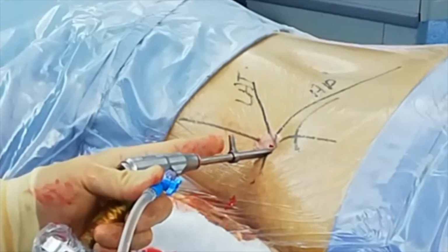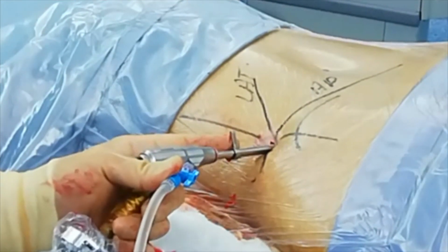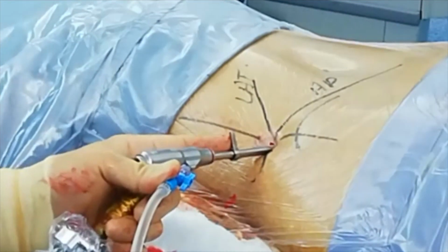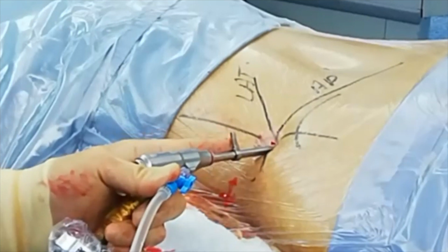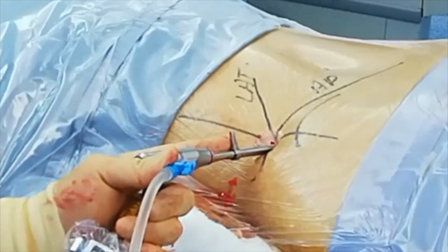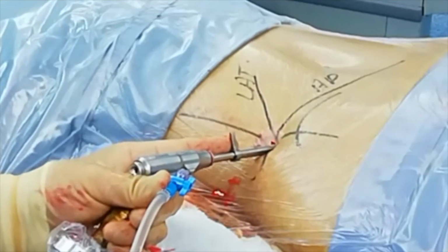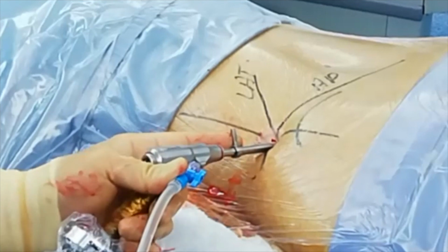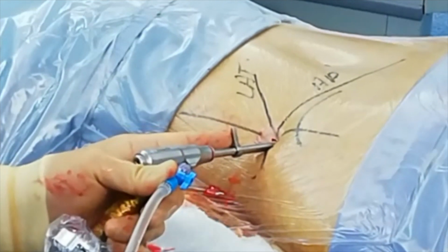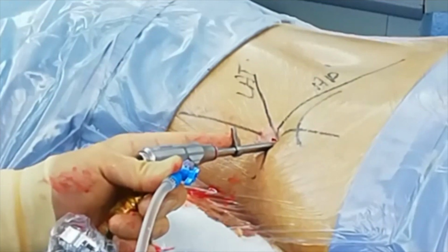Okay, so my left hand is the hand holding the scope and the cannula controlling, so I can zoom in and out. So it's like a pistol, as you can see. I can rotate, I can do all the maneuvers with my left hand so that my right hand can do the work. So the index finger controls the zooming in and out, and it stabilizes the cannula at the same time.